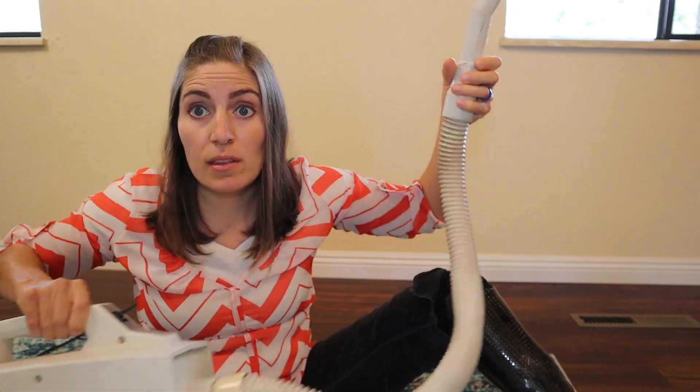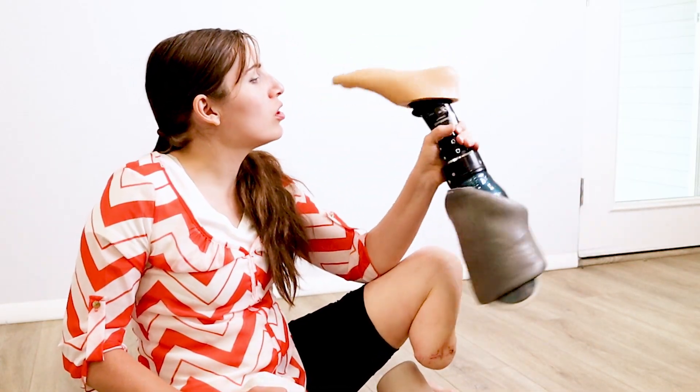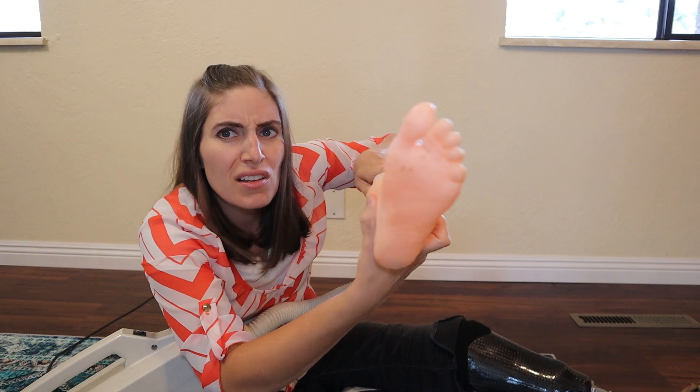Other prostheses use literal vacuums — we need something smaller. There's a little vacuum at the bottom of the socket, about the size and shape of a hockey puck. To put on this leg, I get loaded up, then I push the button and it sucks the leg onto me, just like you can suck a rubber foot onto a cleaning vacuum.